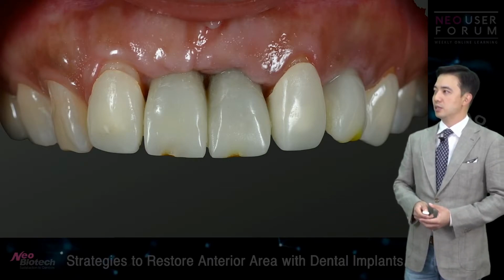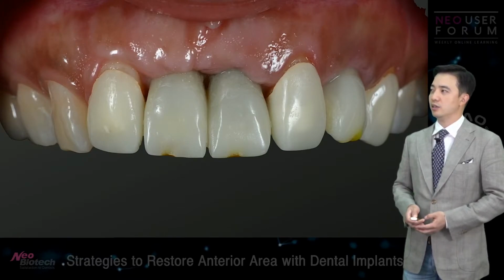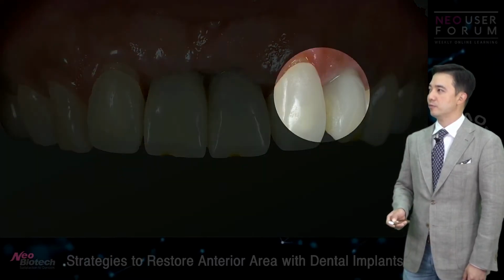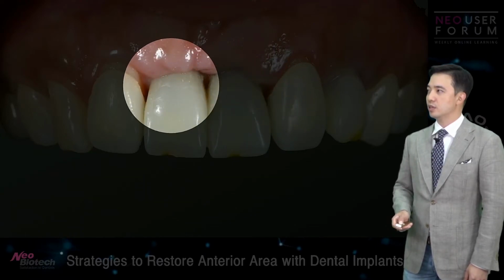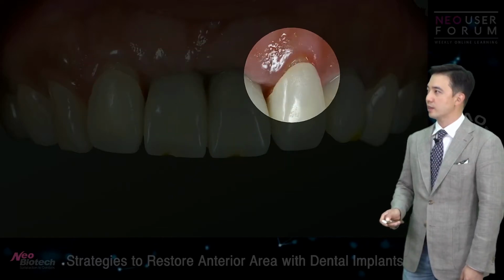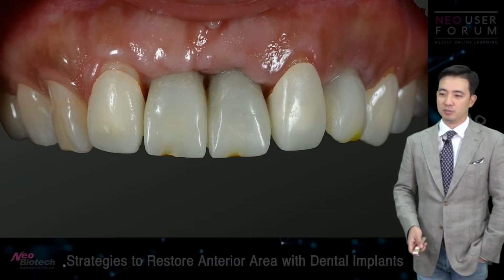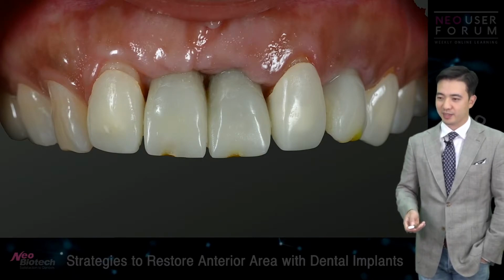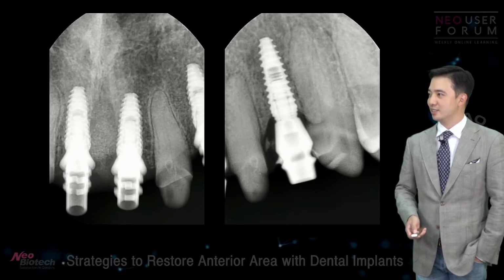Well, the patient tells me that, okay, doctor, we don't see the metal part anymore because those two are covered by resin here. But there's still, we're lacking papilla, and then we're having even more recession on the lateral incisors. And the patient keeps telling me that, oh, doctor, my teeth are getting longer, and I don't like that. I'm like, okay, so I could see this coming.